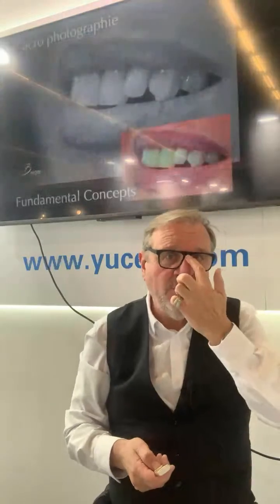If I've done that, I can also make a process to see where is the gingiva and where I have to make the preparation deeper or less. And this is one possibility to use that kind of thing. This is the process for half and half, and we have seen before, and now with the smile design, and you have such a result on this kind of area.